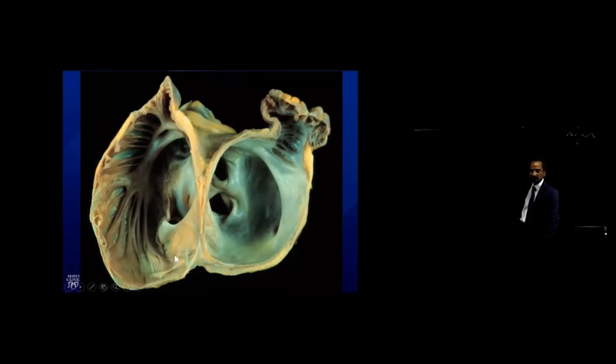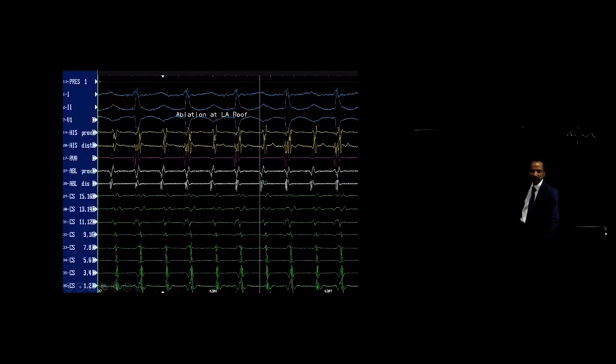something else stimulating it, we can usually sort out by seeing where we have the cycle length of the flutter and by employing entrainment. If any of you have specific questions on entrainment, we can use an opportunity to describe some of the difficulties when we have these multiple arrhythmias or multiple circuits, how we would employ entrainment.